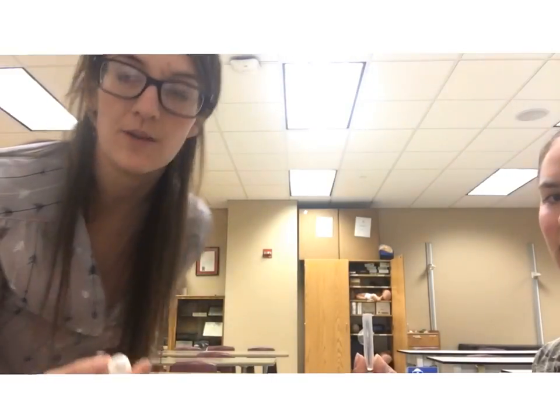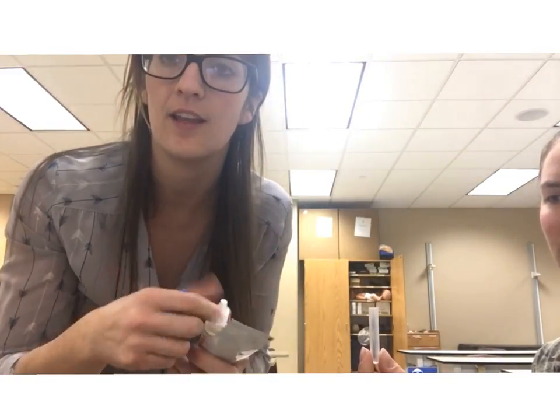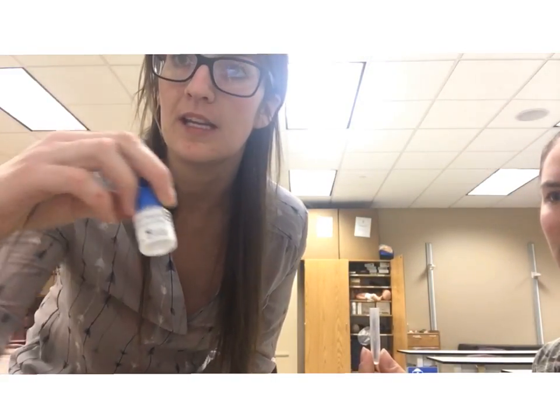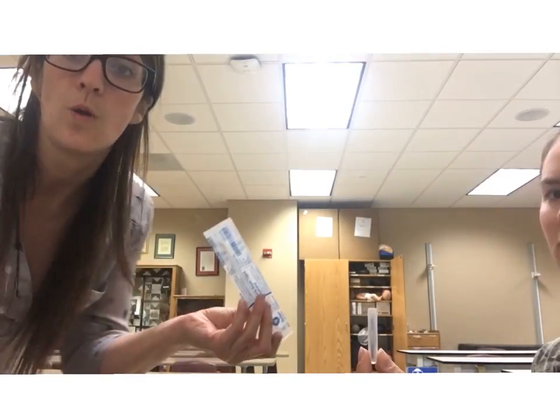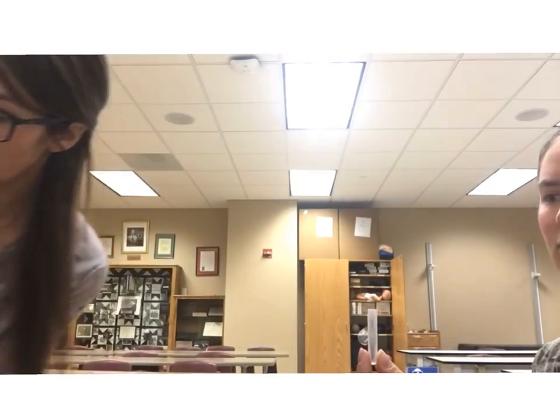For this video we're going to do a strep test. We need a few different things: reagent A, reagent B, a test strip, a test tube, and a swab.